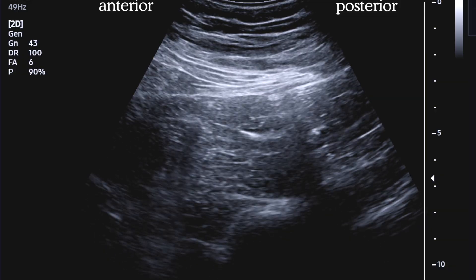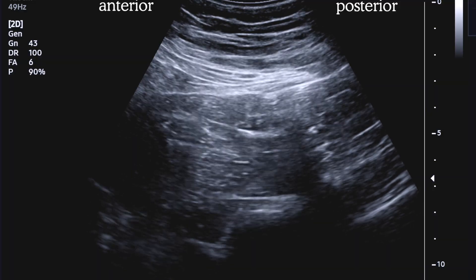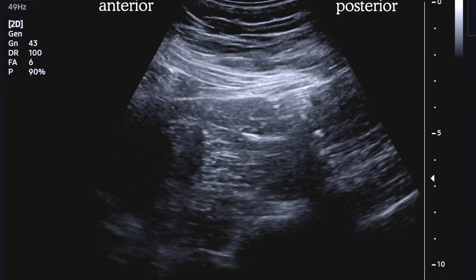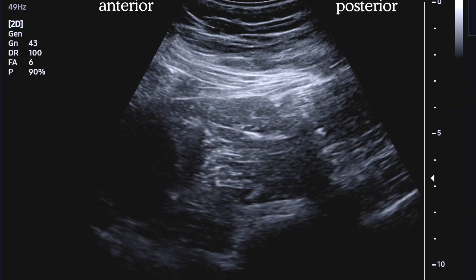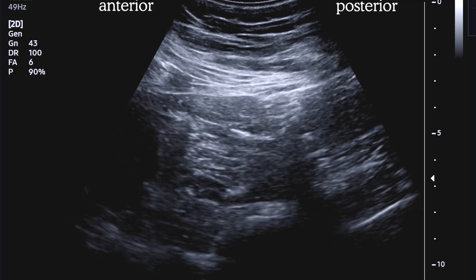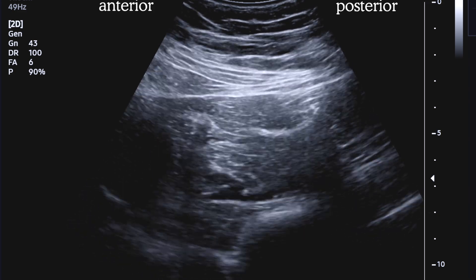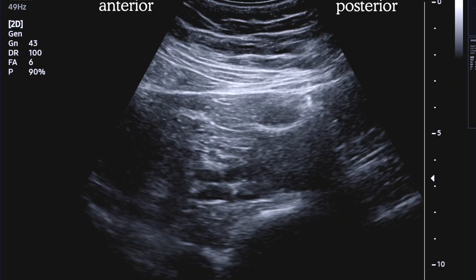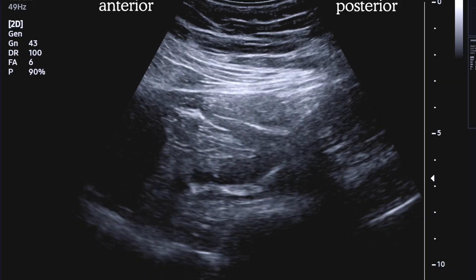This time, when we land in the plane, we have a brisk quadriceps twitch. We aspirate and then start to slowly administer the local anesthetic. You can see the plane unzippering nicely with minimal resistance. We'll give our whole dose here without moving the needle. As the compartment fills up, we begin to see one of the bright lumbar plexus elements totally surrounded by local anesthetic. Nice one.